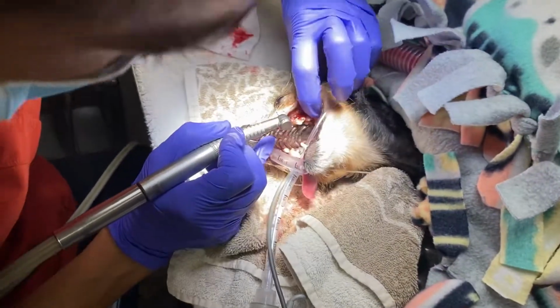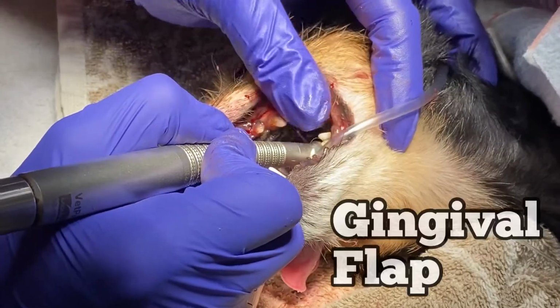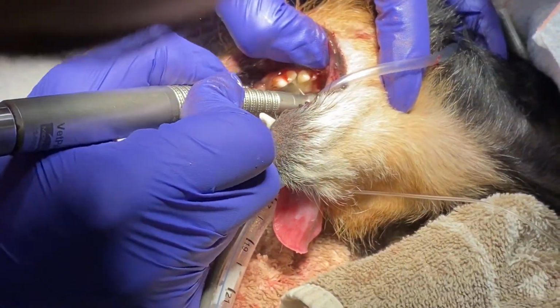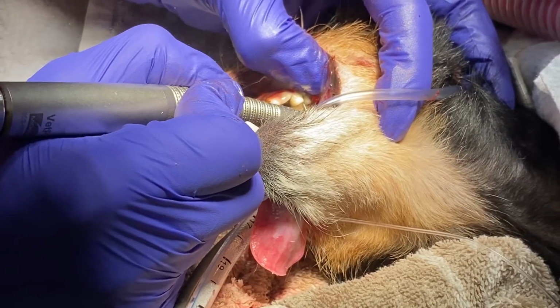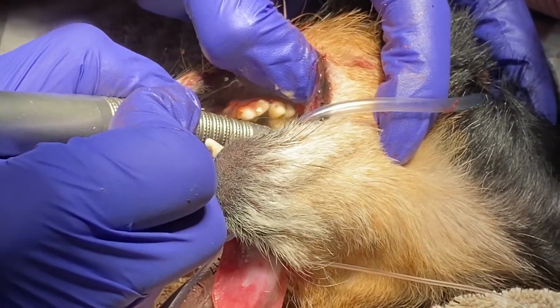Okay, so this is a 3-rooted tooth, and I've gone through and created a little bit of a flap, a gingival flap. So when I go in, I will actually section this tooth into 3 sections to create individual roots. You can actually extract each root individually and not leave any part and piece of a root behind.